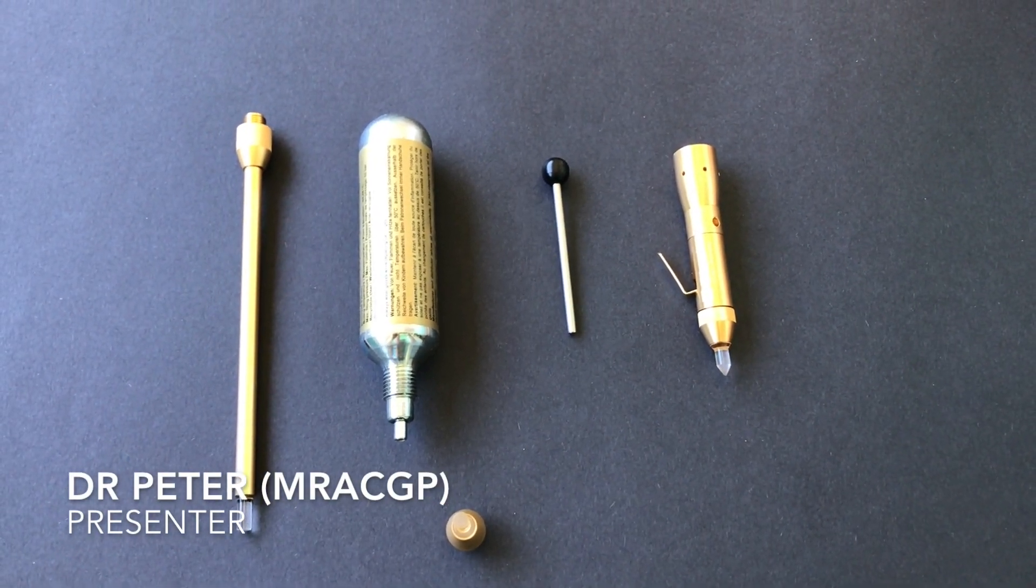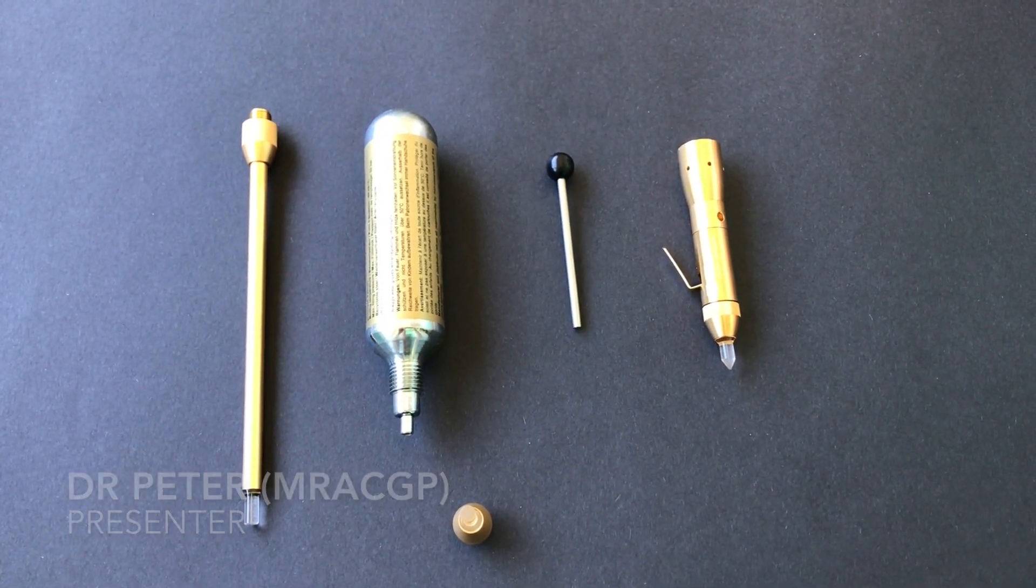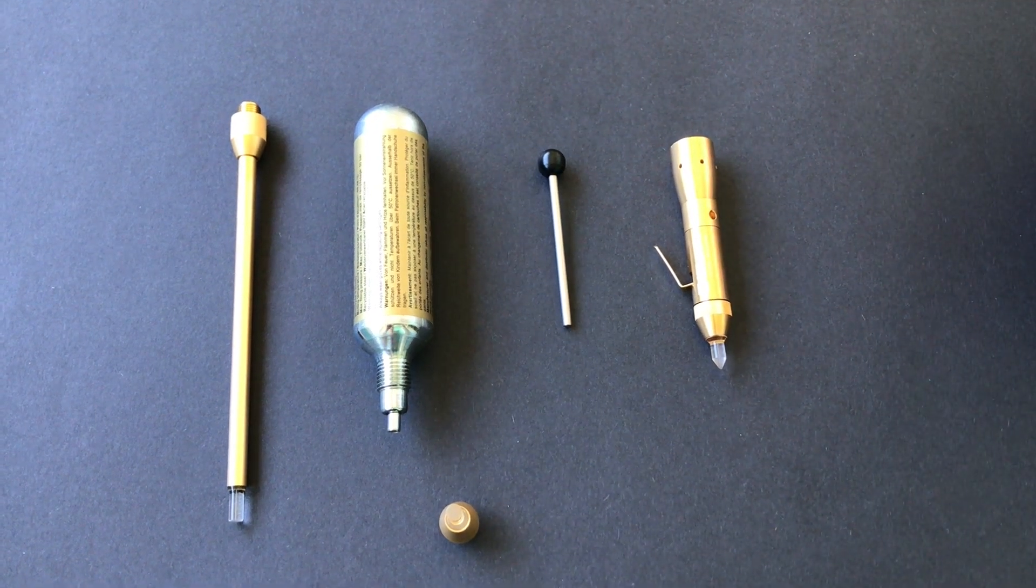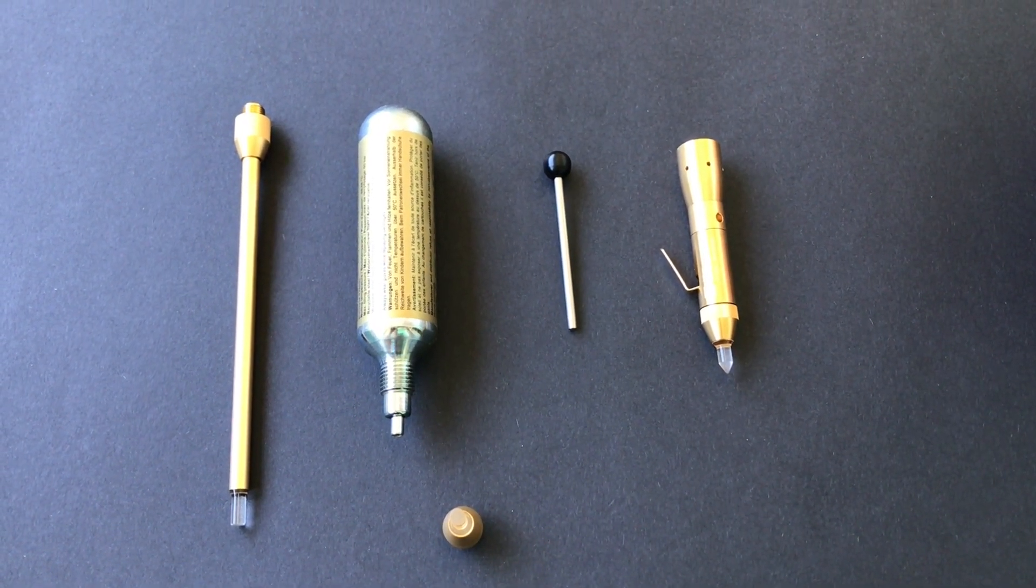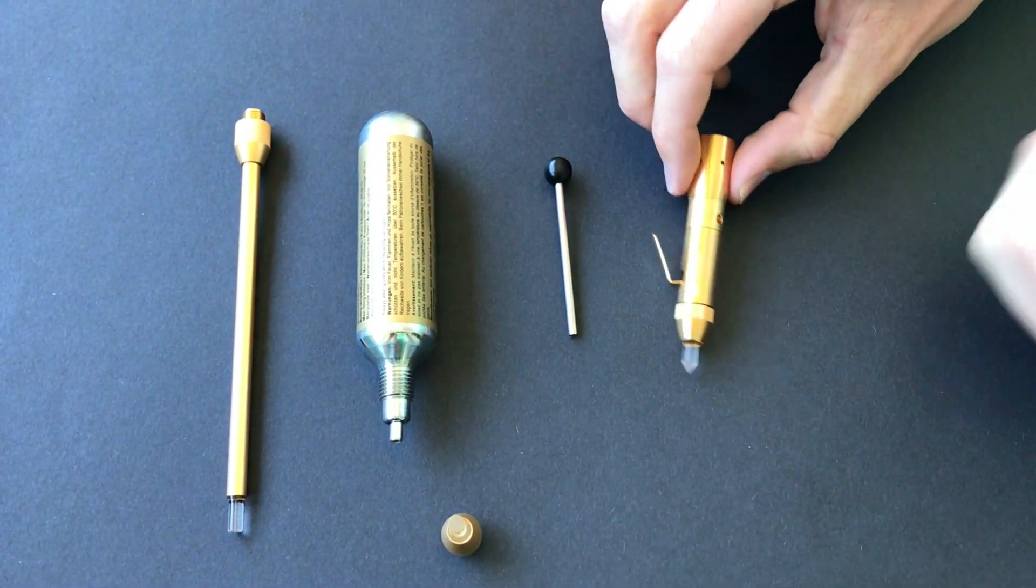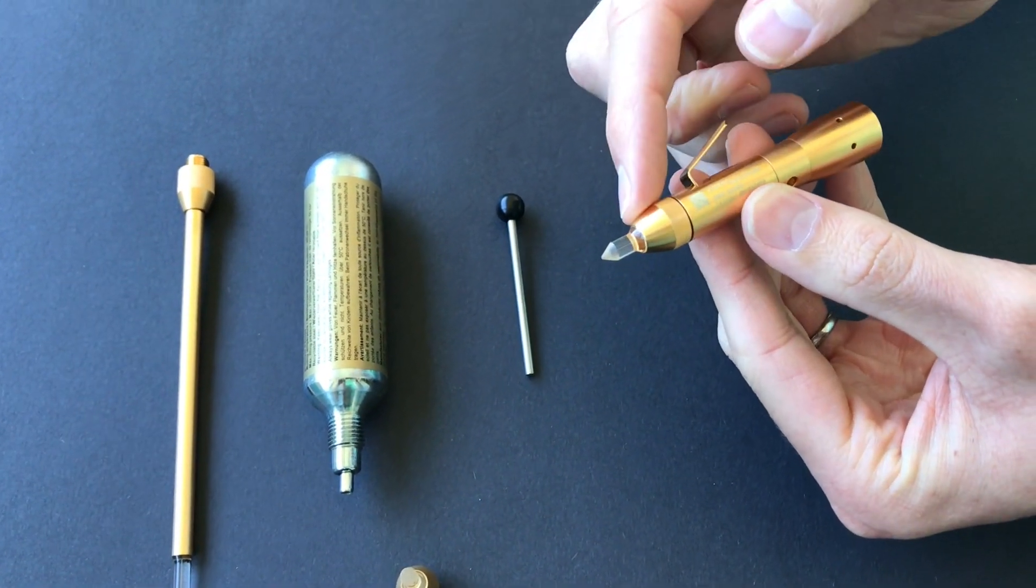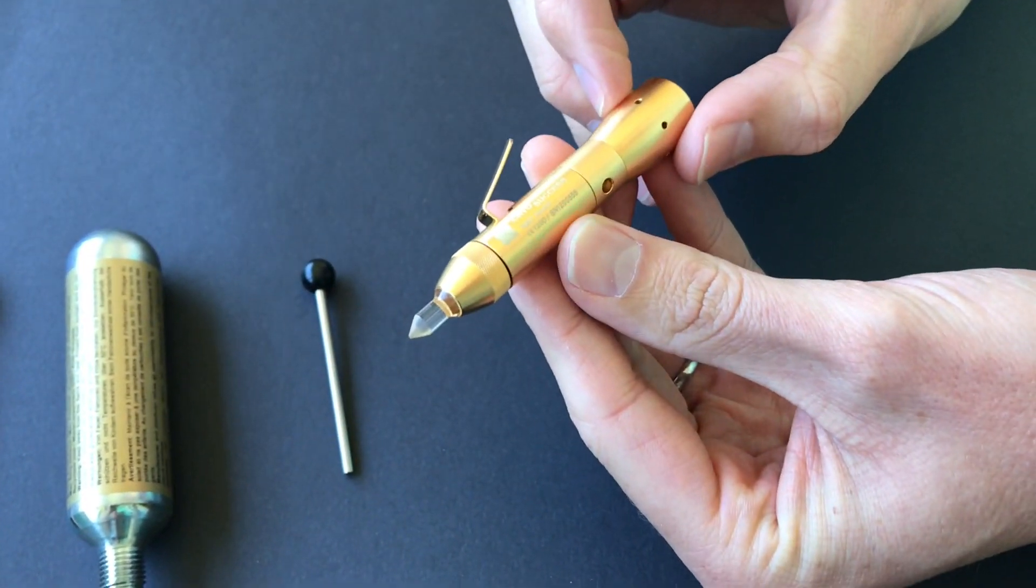Today I'm going to be demonstrating the cryo success cryotherapy unit. I will be demonstrating the use of the product on a common skin lesion. Firstly, I'll demonstrate the cryo unit with current tip applied, which is a one millimeter cryotherapy tip, most useful for most common small lesions.